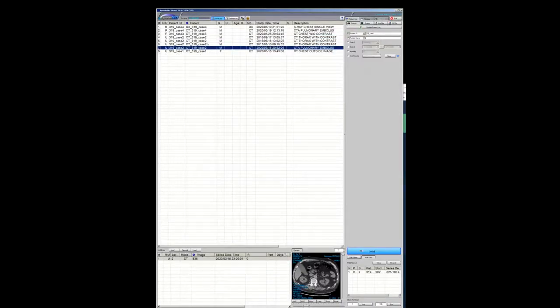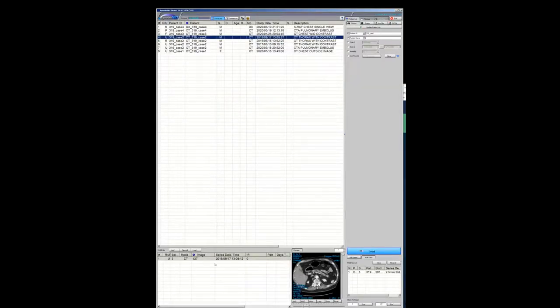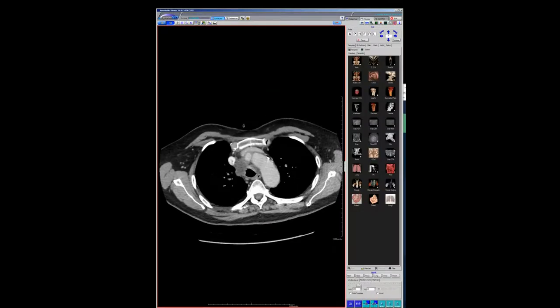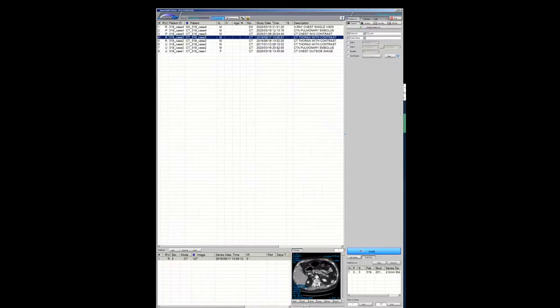What case? Oh, this is really cool because I had never seen it. It's not that exciting, I just thought it was cool. This is a guy who presented with this mass and it was biopsied to be lymphoma. He got radiated and you can see the thing is shrinking. And it's kind of eating into the trachea a little bit. This is his follow up, but let's just go to the final.